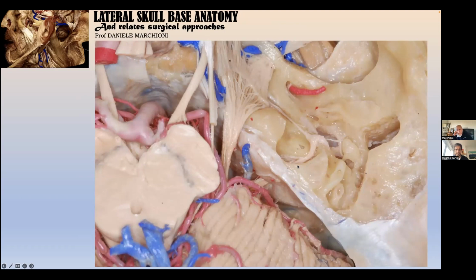So this is the aim of the approach, and why we thought about it, because it's like the anterior skull base. You know that the evolution of the anterior skull base surgery is through the nose and the paranasal sinuses, using a nose corridor in order to reach the target. And the target is the anterior skull base. For example, a meningioma. You can have a small intradural lesion like a meningioma. You can also have some tumor located in the paranasal sinus entering into the anterior fossa, and you can manage it through the nose. Which kind of advantages? The advantage is less manipulation of the brain, working on the target, removing the disease.